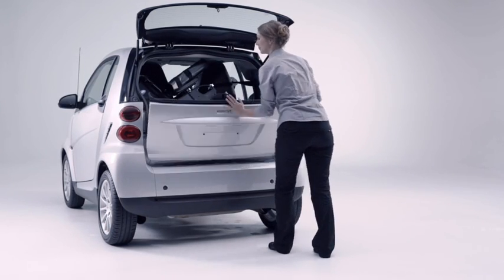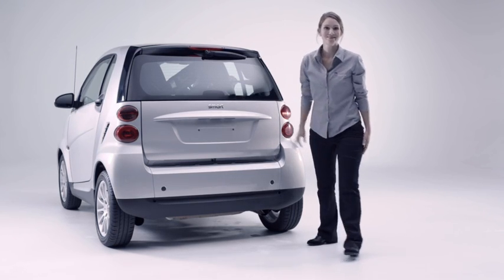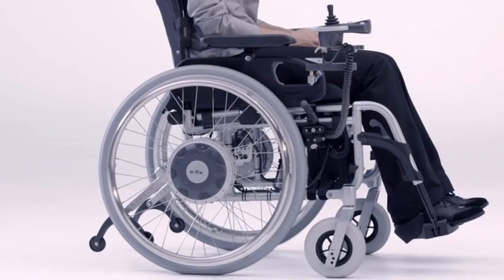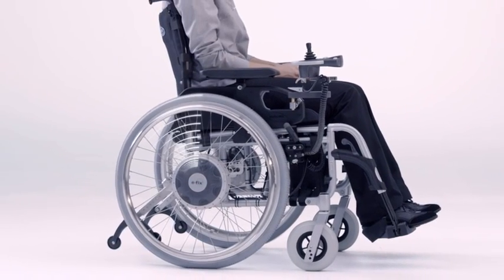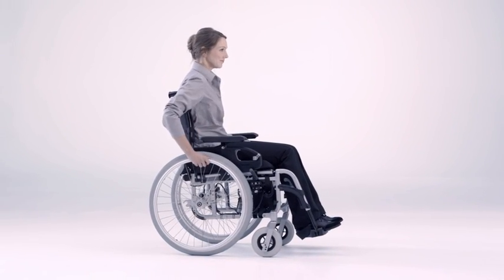You are ready and waiting to go in a matter of seconds. The highlight: the wheelchair can still be used as a normal manual wheelchair. Just couple up the conventional wheels and you have two wheelchairs in one.